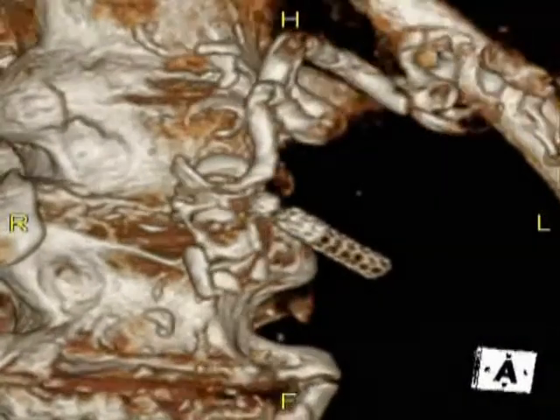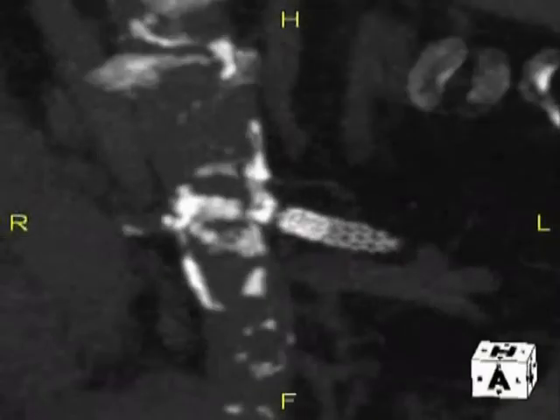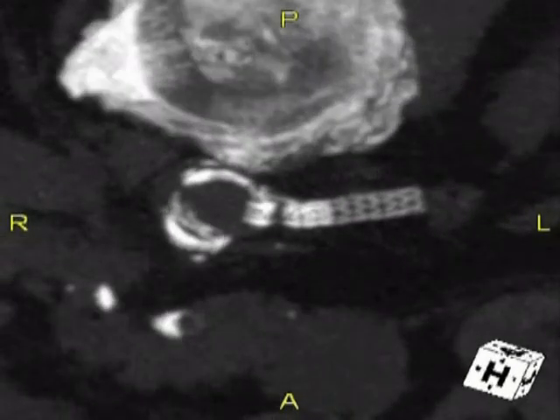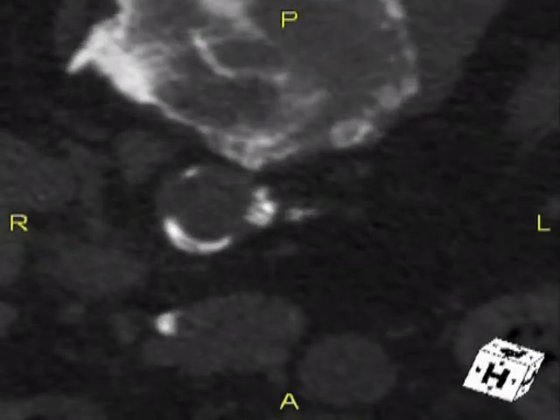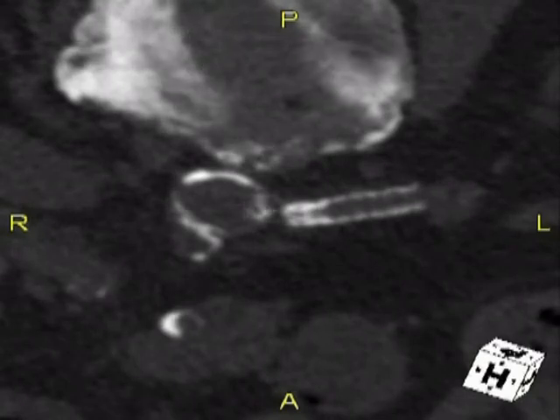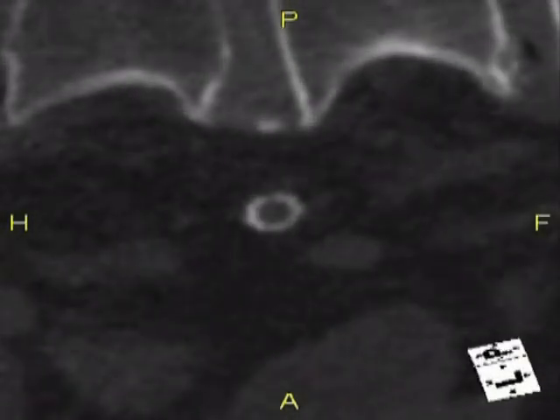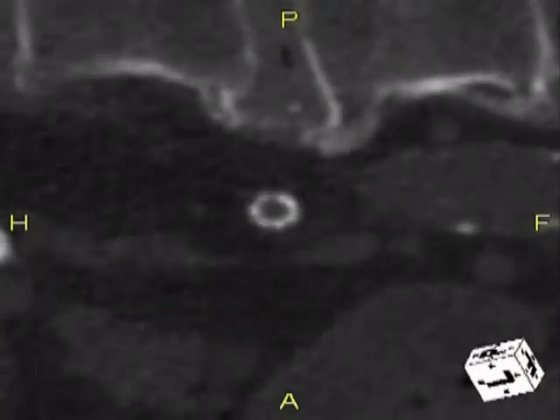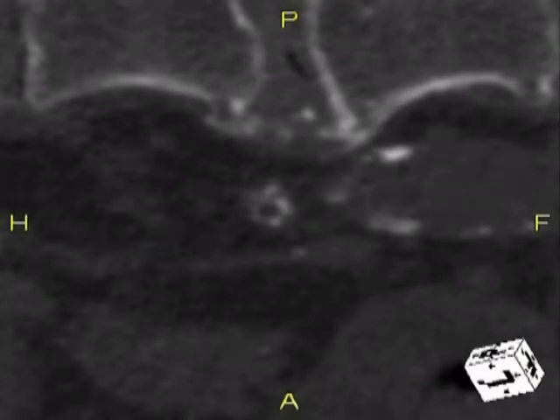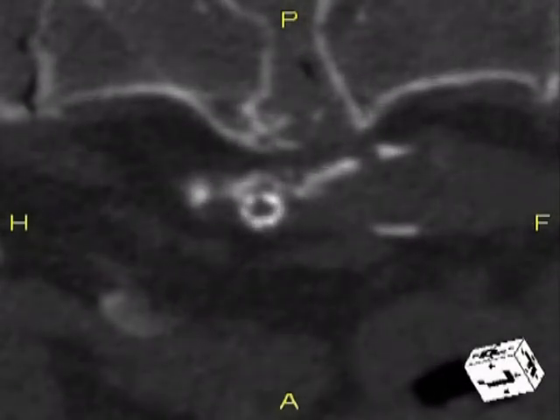The first thing you notice is you see the first stent, and you see the second stent that we placed, and you see this gap in the stent that we placed. And you can see with the thinner images obtained, these are 1 millimeter cut thicknesses, using the MIP image, cross-axial images going down the barrel. You can see the stent on the stent, and then next comes this gap area right there that's very concerning, with very minimal metal, and then starts the ostium, and then there's the aorta.